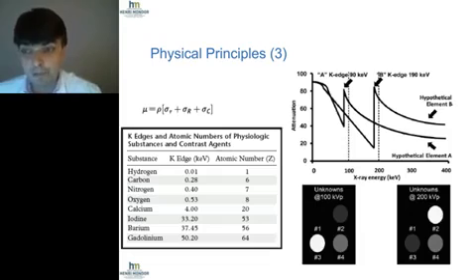Actually, we have maximum attenuation for material B very close to 190 keV, which is the so-called K edge of the material. And we have a K edge for material A, so the maximum attenuation, around 90 keV. If we look at that material 2, here it's imaged at 100 kVp, here it's imaged at 200 kVp, and look at how the attenuation rises here at 200 kVp.